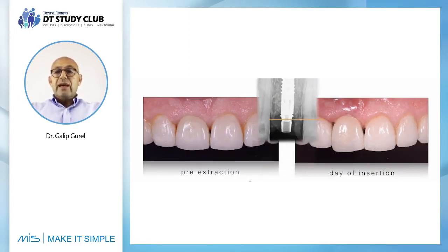So once we have this, I know from day one that if this is the bone peak in here, which corresponds to this level, to the lateral, the papilla between the lateral and central, I know that at least with maturation, we'll have another 2 to 2.5 millimeters of growth.